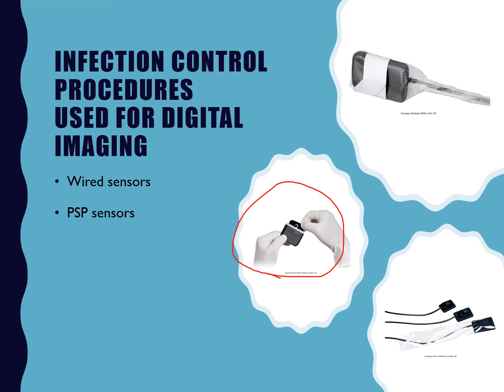It feels a lot like film because you take it inside the mouth and then you go over to the computer and you run it. But it is still a digital sensor, and so it has a reduced amount of radiation. These are the sensors that we were using at my office that I worked at for the longest time, and they're wonderful. They certainly have their drawbacks, but they're still very nice. And I know a lot of offices here in San Antonio are using these, so you need to be at least aware that they exist.